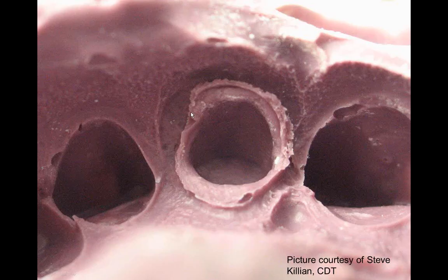This is pretty common, classic. You can see this air entrapment right at the marginal area. We've done it over several different areas. We just didn't get this area dried out enough. We still have that same kind of funny, garbly looking stuff as we go down into the sulcus with this impression. Probably you're going to get a pretty decent margin there, but what are we going to do here? Let's take a look at it when it's poured.